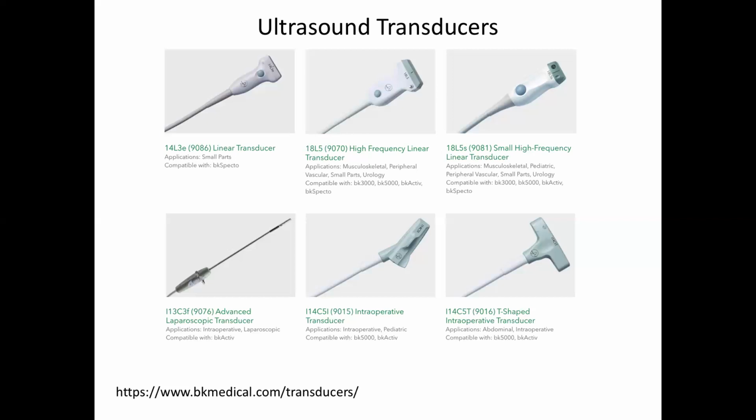So when you moved the biopsy tool, you knew precisely where the tip was from where those balls were in 3D space. And you had an ultrasound transducer imaging the volume. You knew from the way the handle was on the ultrasound transducer exactly where that volume is. And so they could align both those things and then use the biopsy tool to hit the target. It could be a very small target and you would nail it right on. And then usually with those things, you suck out cells, right?